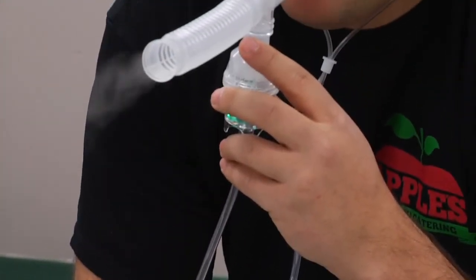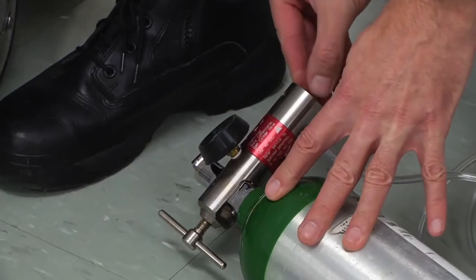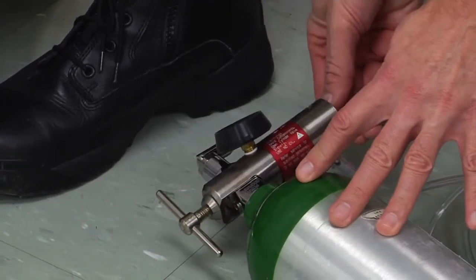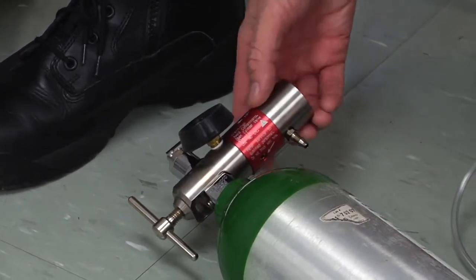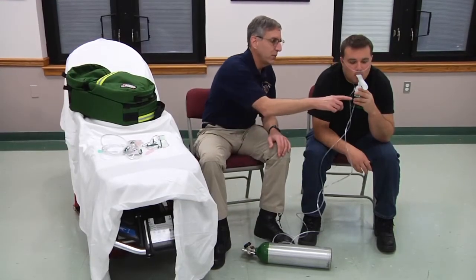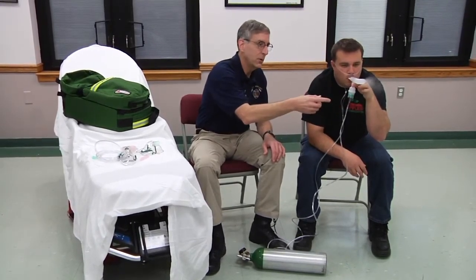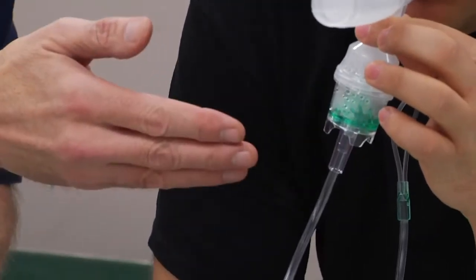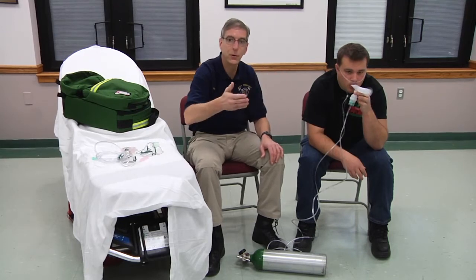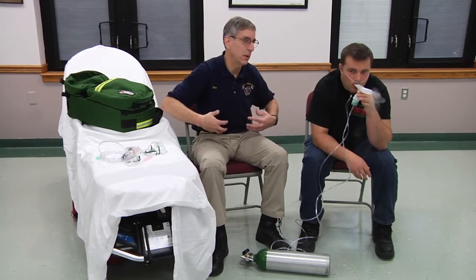If I turn this flow rate up, you'll actually see at some point that it will pop off of the nebulizer. This piece here, where it connects, is oftentimes where it pops off. I'm currently at 20 liters per minute and it has not popped off. If you can deliver the nebulizer at a faster rate, the particles are smaller and they'll penetrate deeper into the lungs.